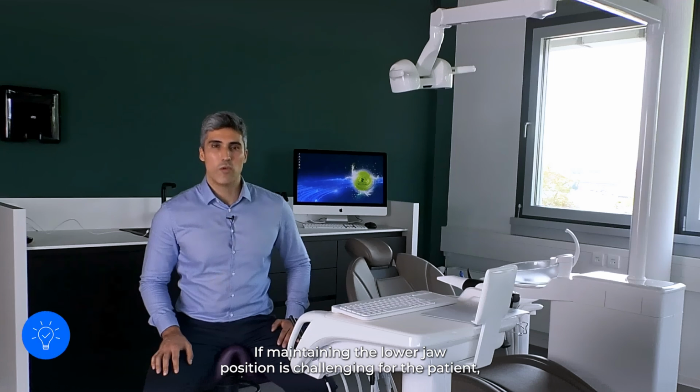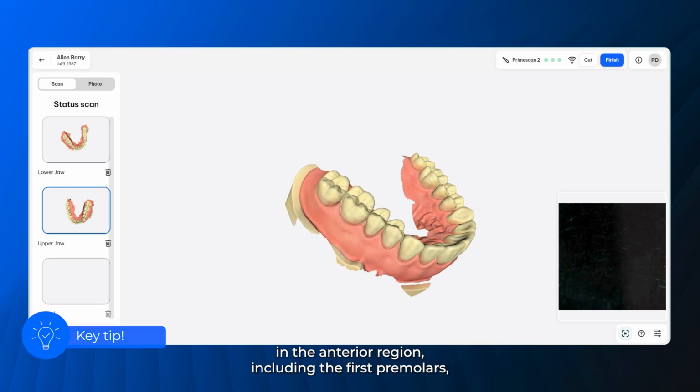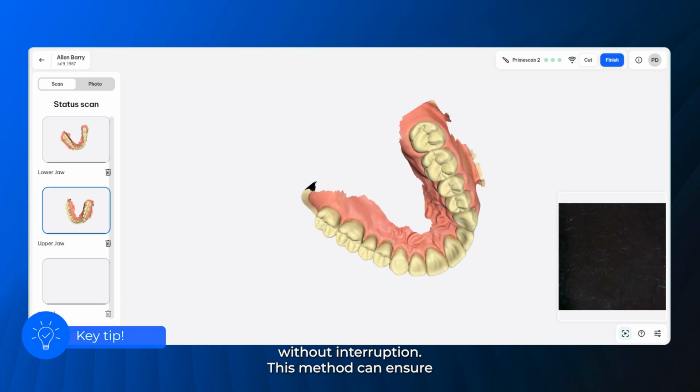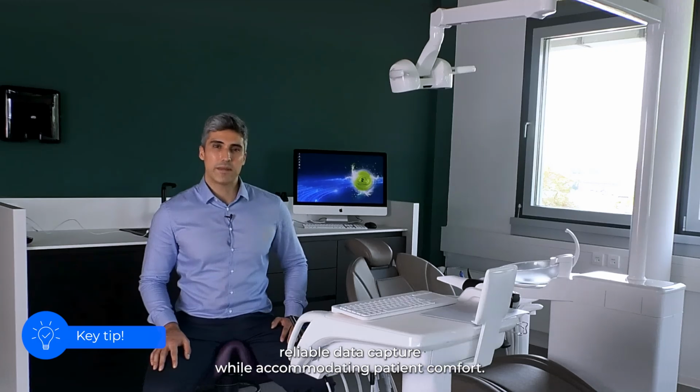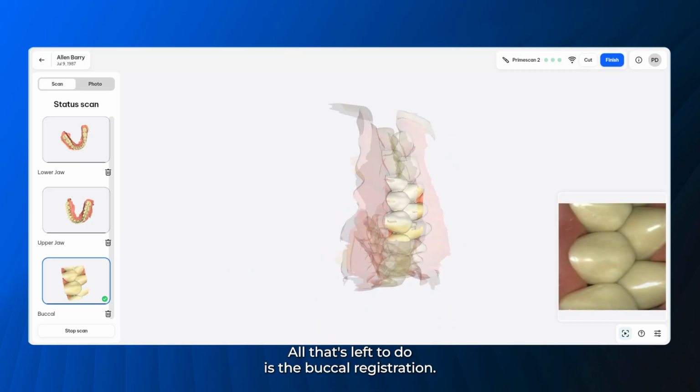If maintaining the lower jaw position is challenging for the patient, an alternative approach is to use one continuous scan path in the anterior region, including the first premolars, without interruption. This method can help ensure reliable data capture while accommodating patient comfort. All that's left to do is the buccal registration.